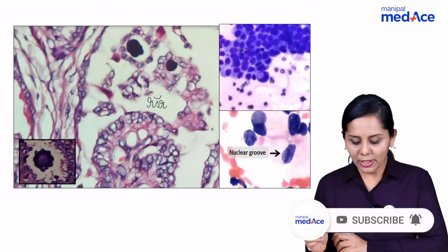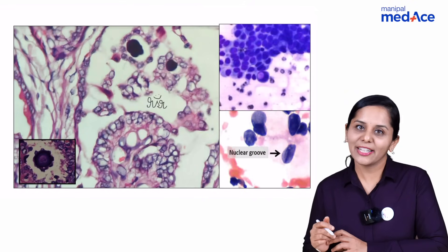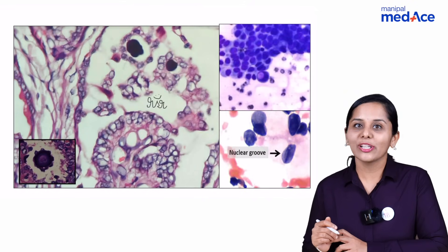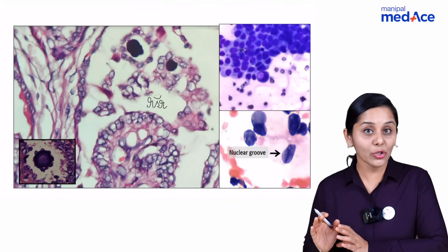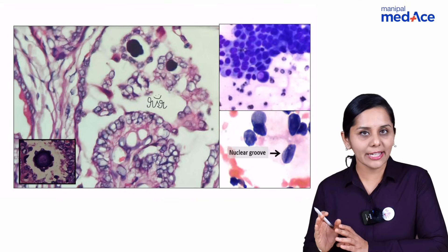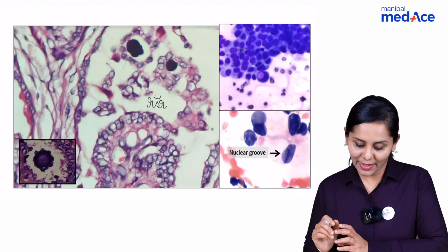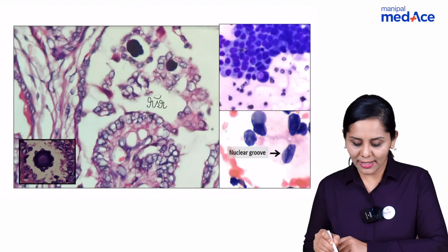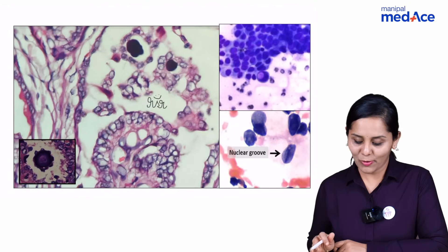Next, what you need to observe are nuclear features like nuclear clearing, intranuclear cytoplasmic inclusions, as well as nuclear grooves — which are the key characteristic features of papillary carcinoma of thyroid. Along with that, psammomatous calcification like this will also help you to identify papillary carcinoma of thyroid.